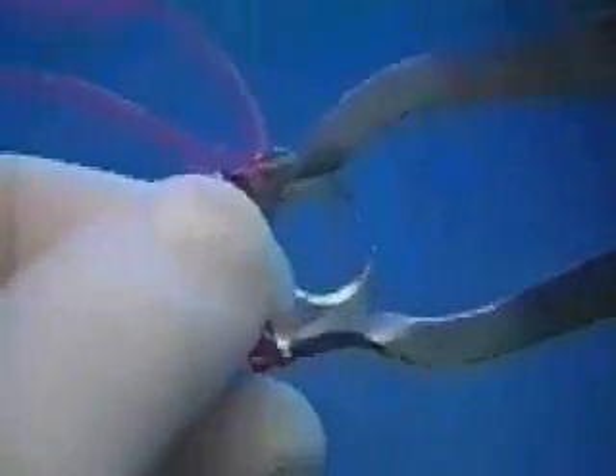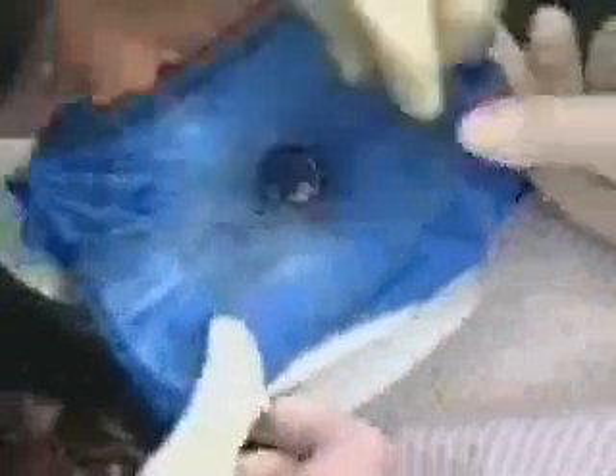Now you are ready to engage the clamp with the rubber dam forceps. The clamp can be secured to the tooth in one of two ways: it can be placed on the tooth prior to rubber dam placement, in which case the rubber dam is stretched over the clamp; or it can be placed simultaneously with the rubber dam, in which case the clamp is placed in the rubber dam prior to them both being brought to the mouth. Either method is fine as long as the clamp has been securely tied with floss.